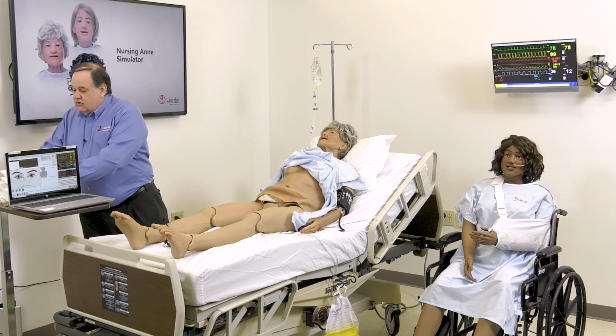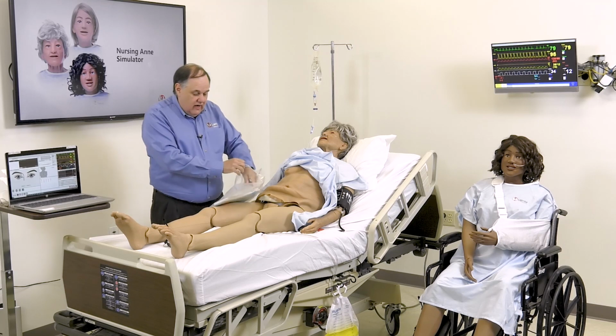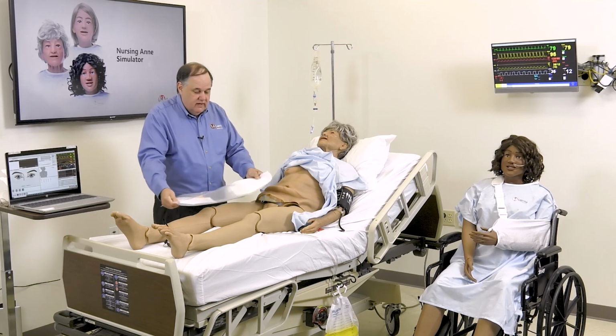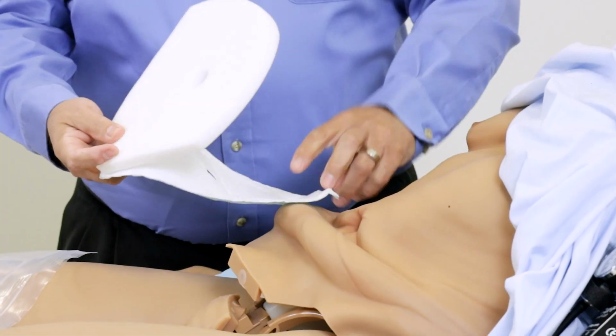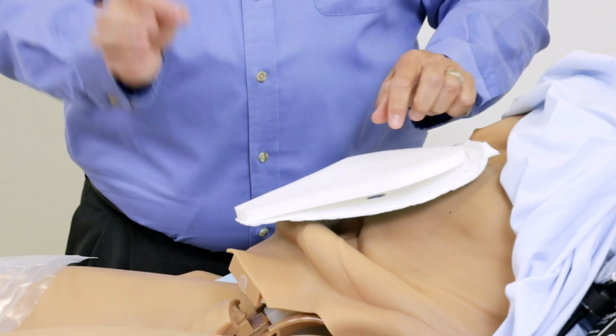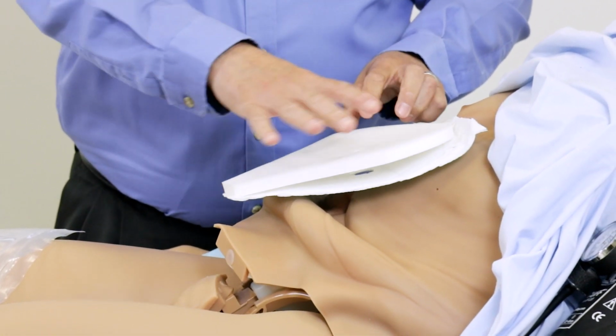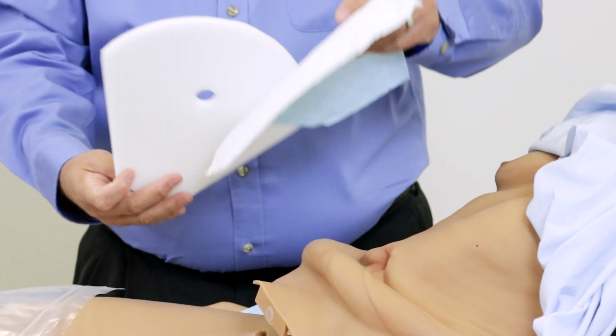Alrighty, thank you. I actually have another question here. The subcutaneous lining, does it need to be removed after each use? Not necessarily after each use as far as administration, but if we pull the subcutaneous injection pads out, you will see there are two parts to them. There is a foam part that sits under the abdominal skin and a pad that soaks up that fluid. As the needle penetrates and we put fluid in, it's absorbed through this. So when this becomes saturated, it's important to remove it.